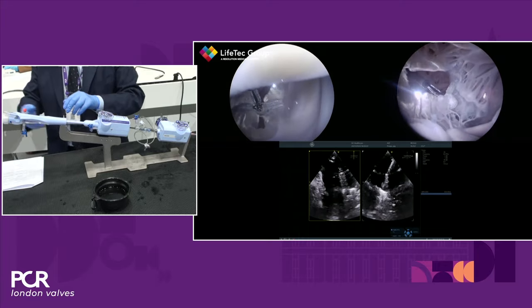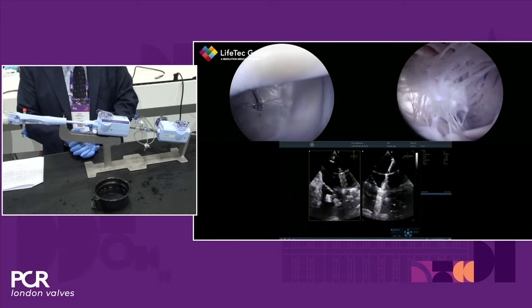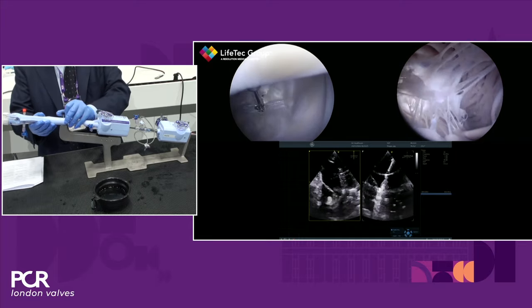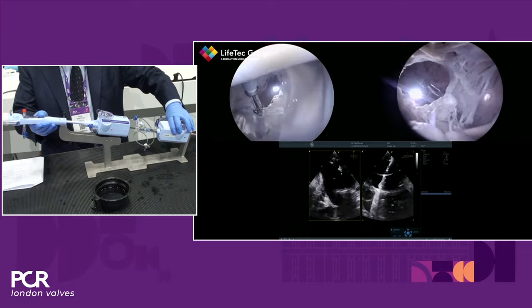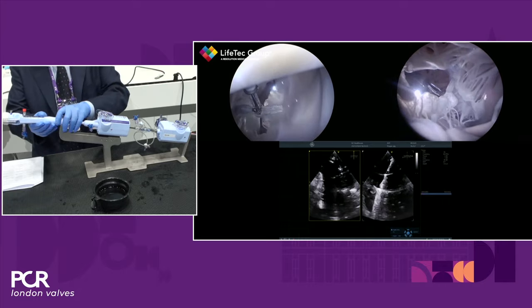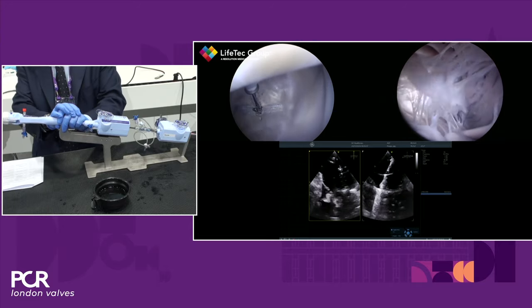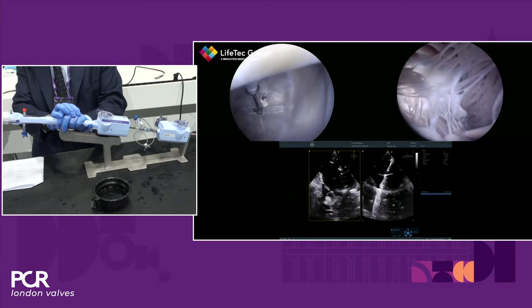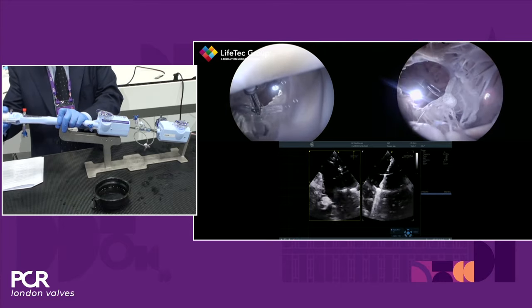We use a lot of transgastric views. We use 3D, but 3D doesn't really work in most cases because of the position of the esophagus. And sometimes in tricuspid, as you said, there is a lot of variability. We have seen one heart with a four-leaflet configuration. So we really need to take into account the different possible anatomical variations of the valve and respect them when we orient our clip arm.